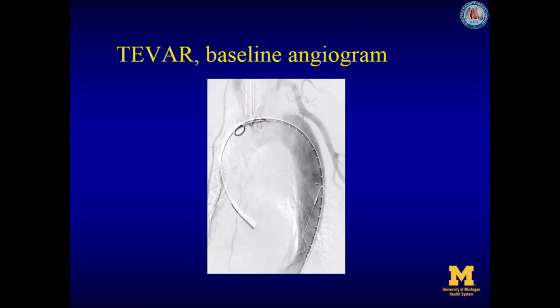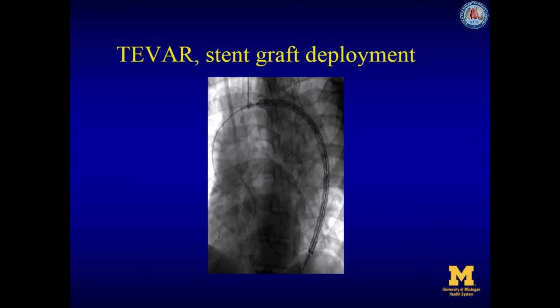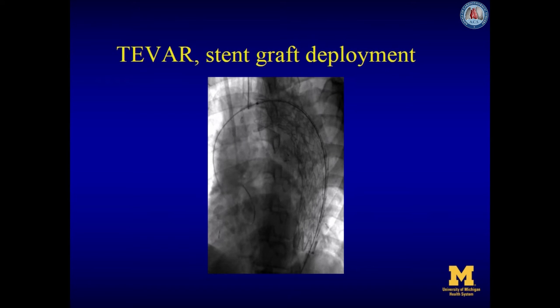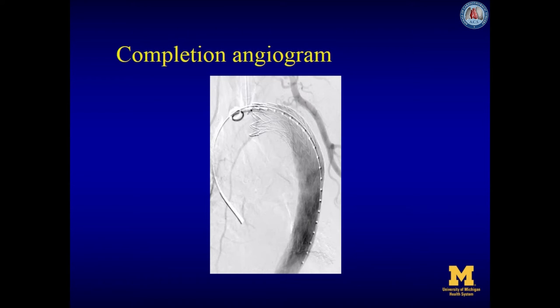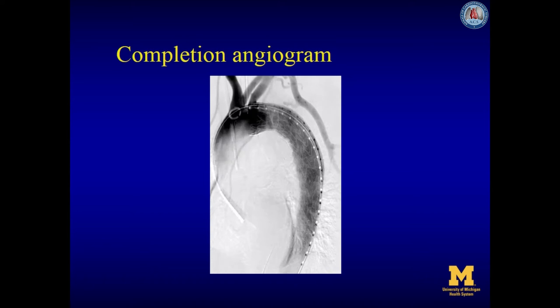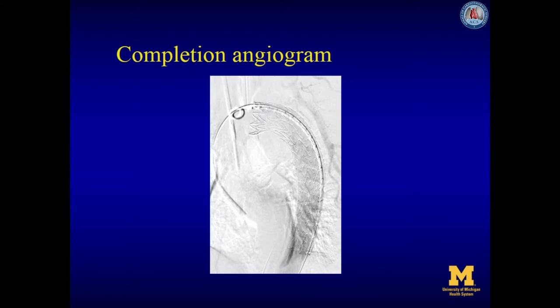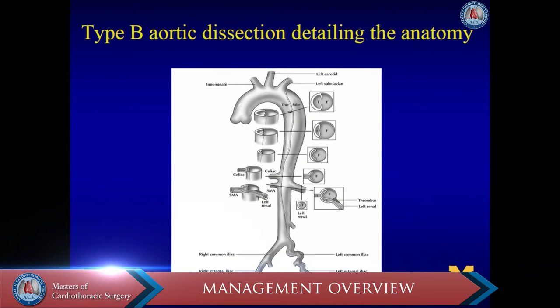The baseline angiogram shows perfusion in both true and false lumen, and true lumen narrowing in the distal descending aorta. The patient is selected for TEVAR and the CTAC device is slowly deployed starting from the mid portion of the stent graft delivery system, with subsequent adequate positioning in the thoracic aorta. Completion angiogram shows the stent graft deployed just distal from the left subclavian artery with adequate perfusion of the supra-aortic branches and immediate true lumen expansion in the distal descending aorta.